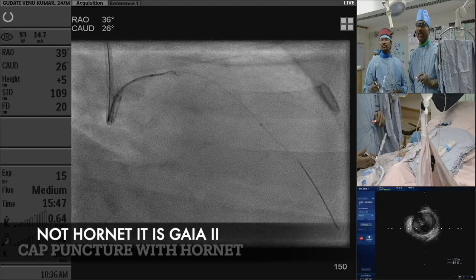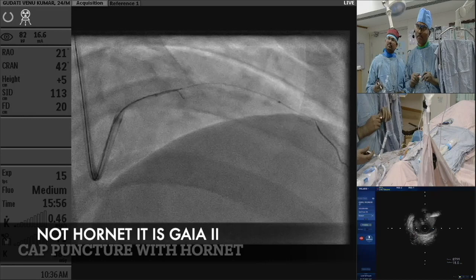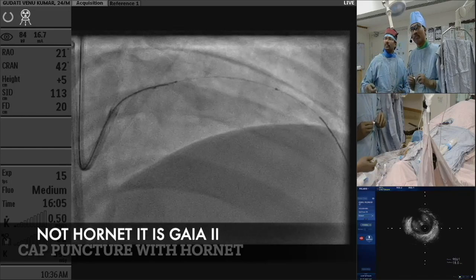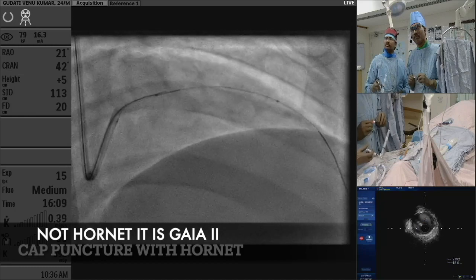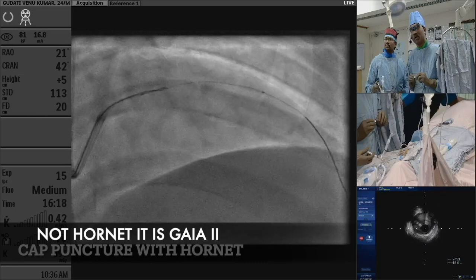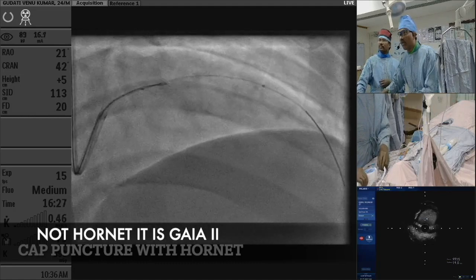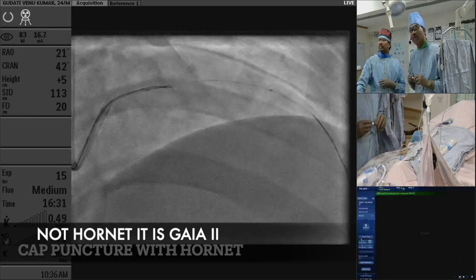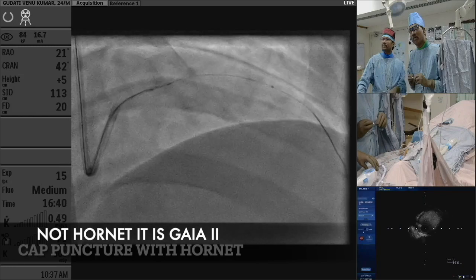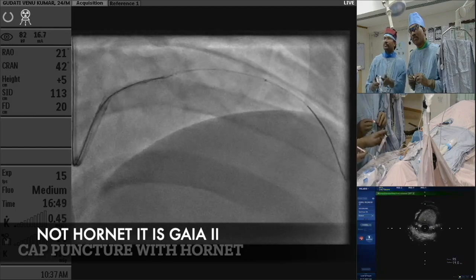Go to epicranial. Hey, go to lateral, please.